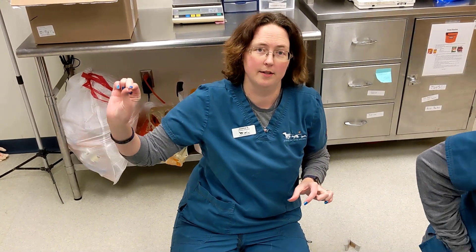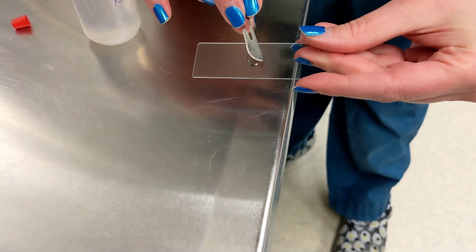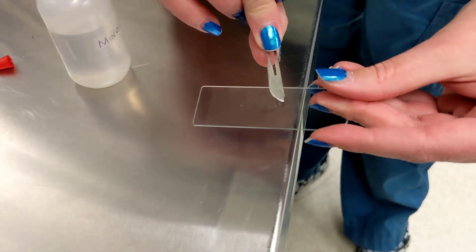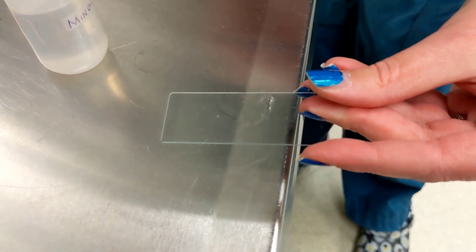Each time we scrape, we're going to add it to another spot on the mineral oil on the slide, and then look at it under the microscope. So we're going to dip this into our mineral oil, and you're going to be able to see those hairs and those skin cells in the oil there.